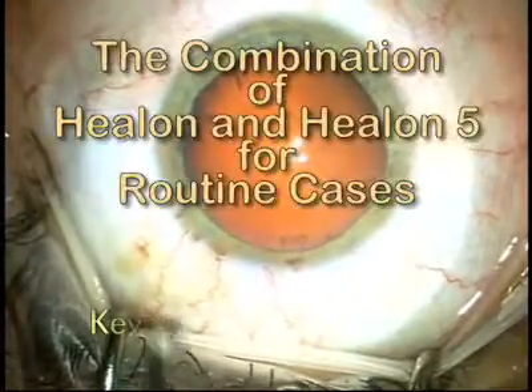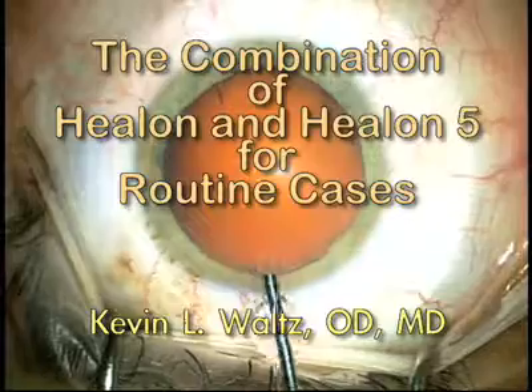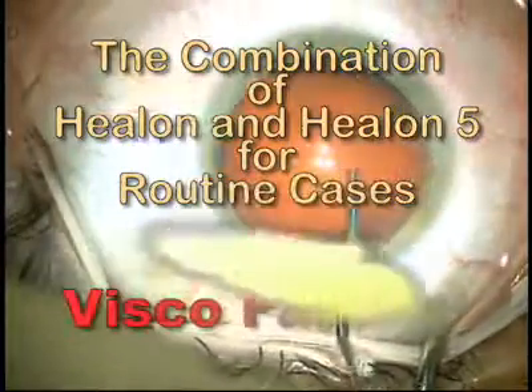This video shows the combination of Healon and Healon 5 for routine cases, or as I like to call it, the Visco Fastball.